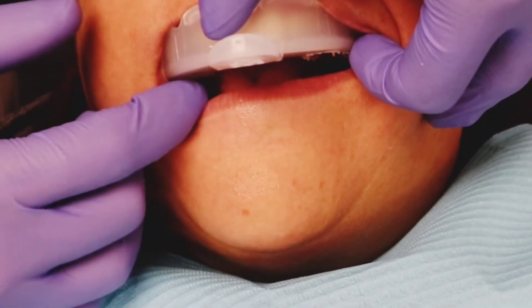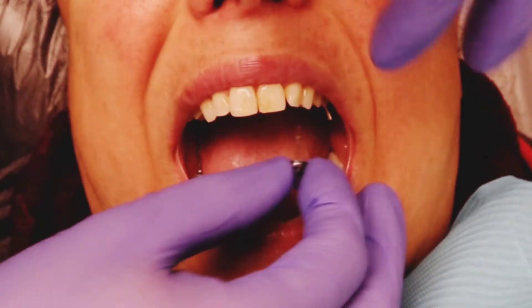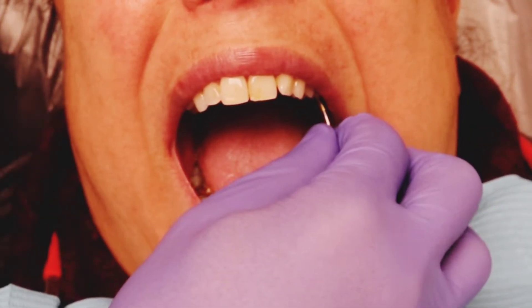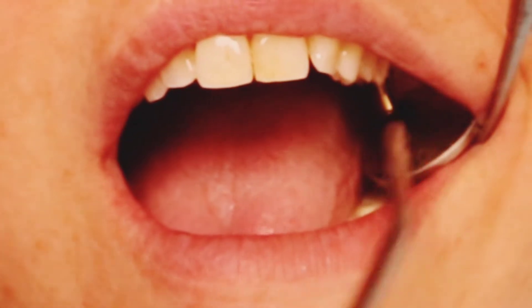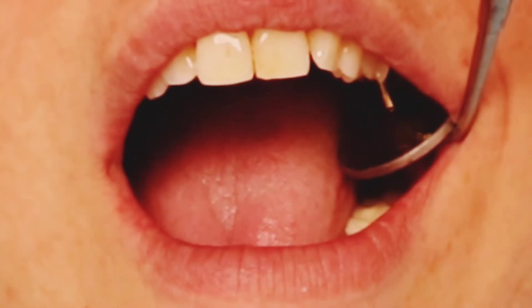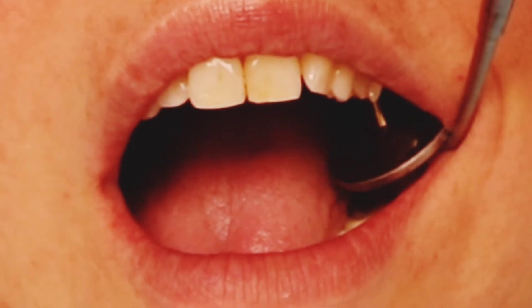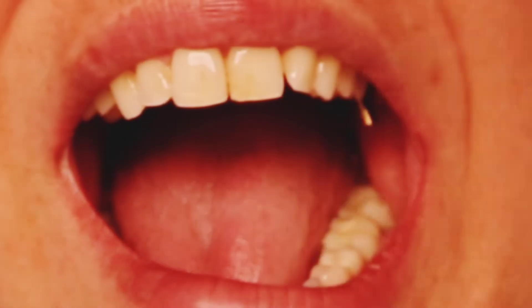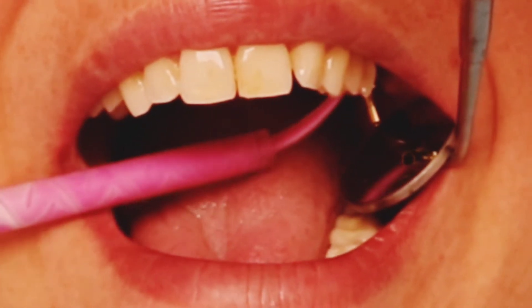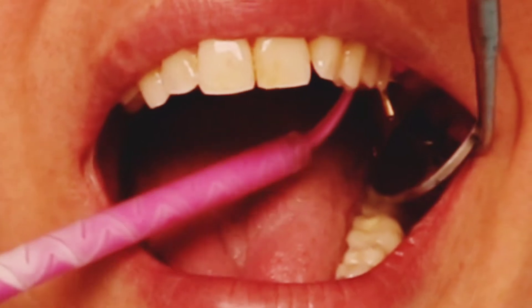Here I've sized everything up and I'm making sure the impression coping is nice and tight. Then we'll get started on taking the impression. Right now I'm air drying the impression coping, and then my assistant is going to pour in the light body PVS over the implant site while in the back she's using the heavy body material at the same time.